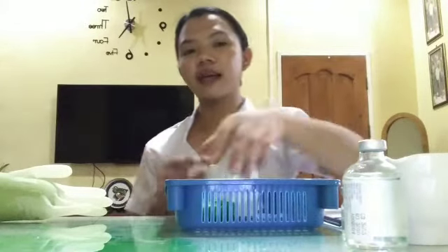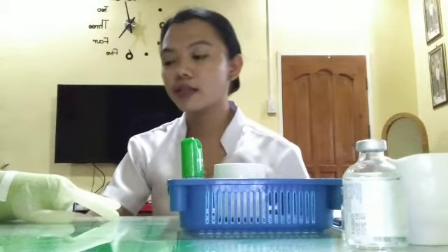So assuming that I am already here on the bedside of my patient, next I will identify my patient's identity. I will check the identity of my patient by asking his or her name or reading the name on the wristband. So my patient is Miss Lorna Lopez. I will introduce myself, and then I will explain the procedure that I will be doing. Hello ma'am, my name is Ayessa Camille Dumile. I am your student nurse for today, and I will be doing the intramuscular injection.